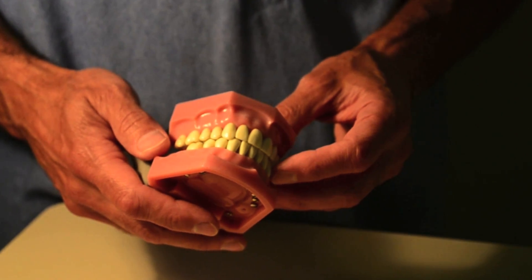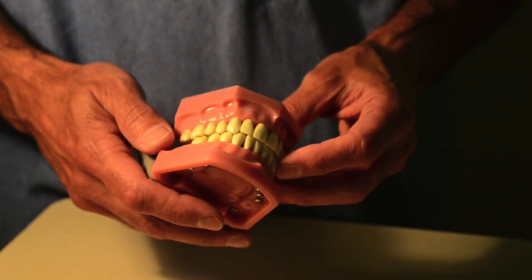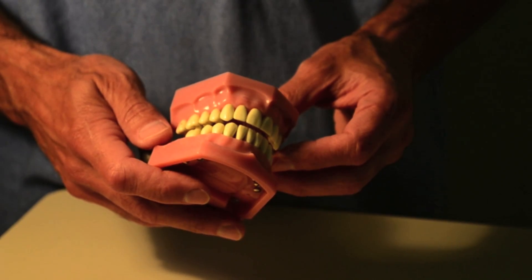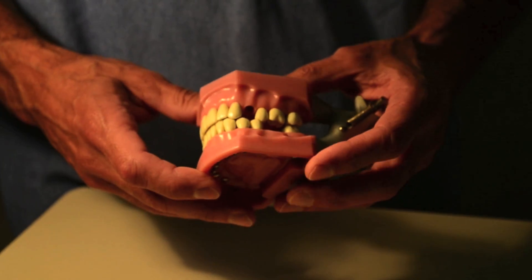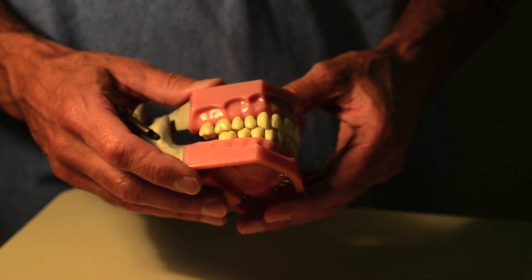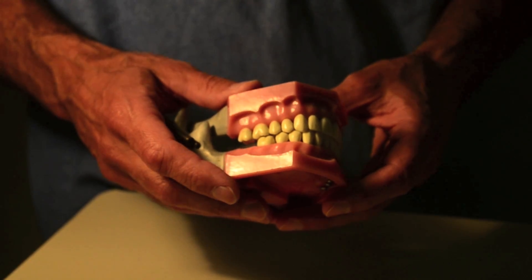Now I'm going to talk about placement of arch bars on the maxilla and the mandible for fixation of both mandibular and maxillary fractures. Generally speaking, when comparing the indications for arch bars versus ivy loops, ivy loops are usually used to treat only the simplest fractures.